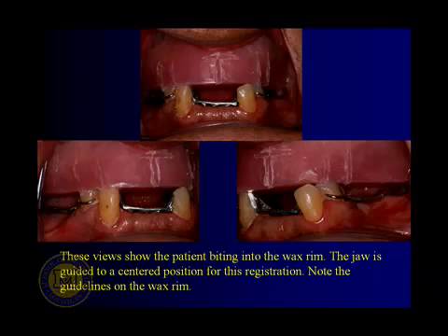Hold it in the center of the roof of their mouth for 3 to 4 seconds. And that adhesive stuff will keep the upper record base stuck up there. So you literally glue it in. And that's okay. What do you suppose the patient's first words to you are when you glue in the record base?